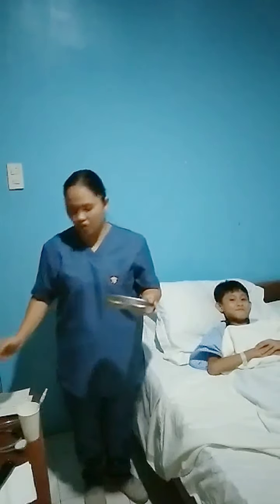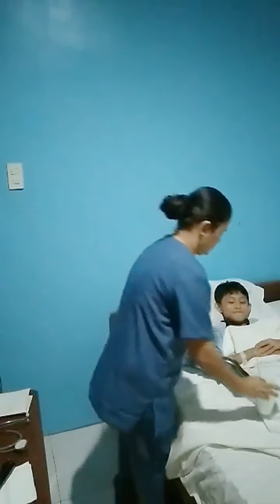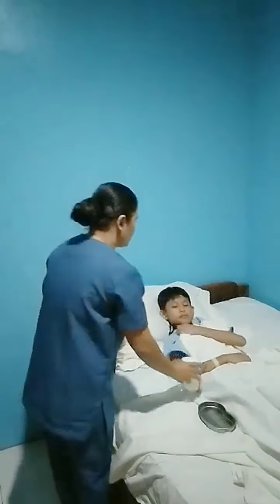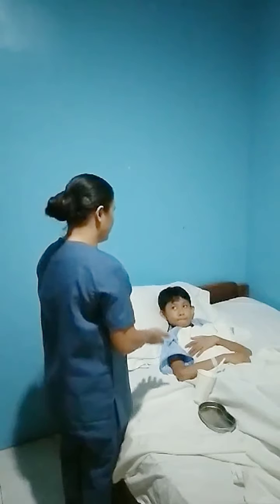Next, we need to have the kidney basin on the side of our patient as well as the glass of water with straw. So Ryan, you are going to sip and swallow water from this glass with a straw later on to help us with the insertion. Okay, so we can have that ready on the side of our patient.